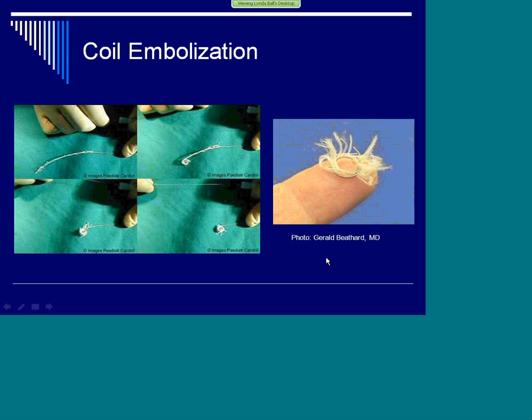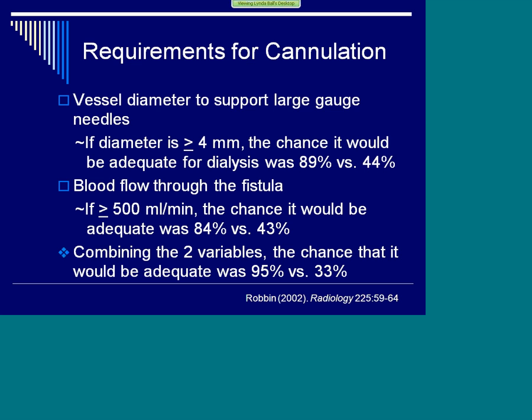So as they feed it into the vessel, then it goes in. You can see it nice and straight. As it goes in, it starts to curl, and it curls up even more. And by the time they get it all deployed, it has filled up the diameter of the vessel. And then, of course, it attracts all the platelets, and then fibrin forms, and then you have a clot, and it clots off that extra vessel.